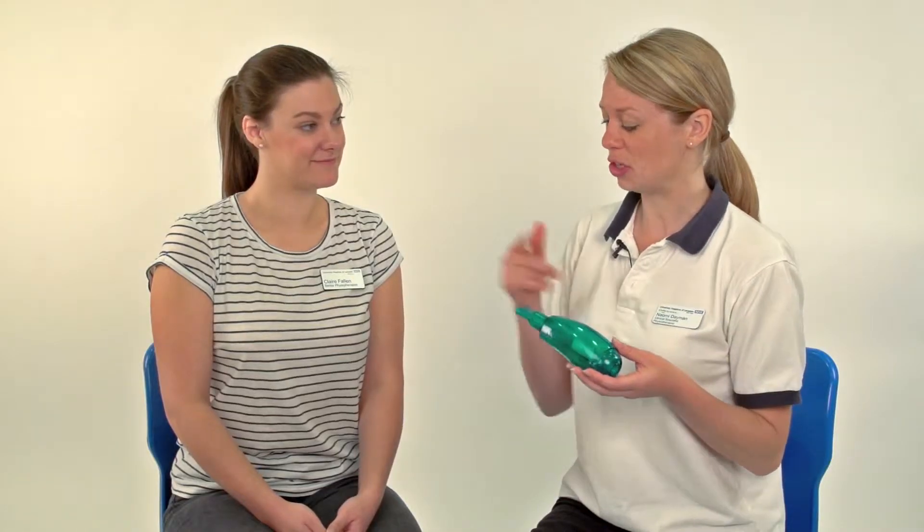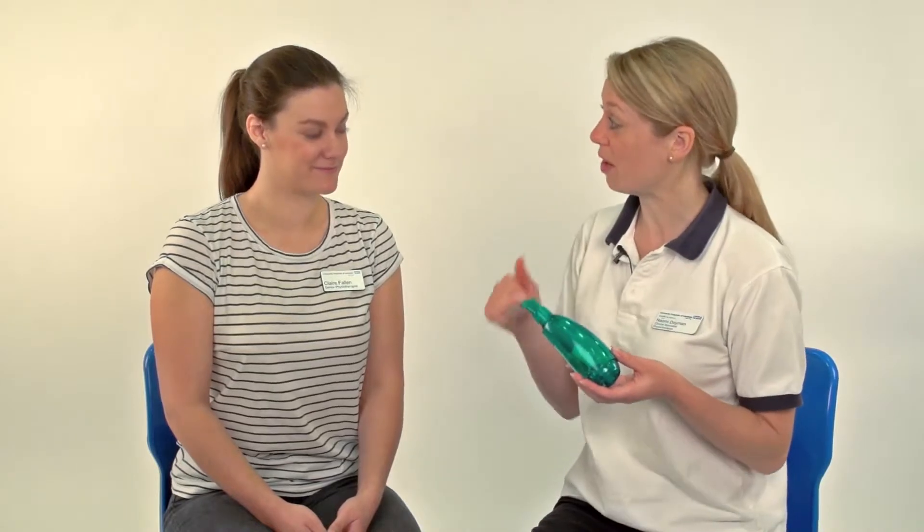The Acapella is something that you can only do when you're able to blow and breathe out through a mouthpiece. So if you're a baby then this wouldn't be a possibility to use, because you need to have a good seal around the mouthpiece.